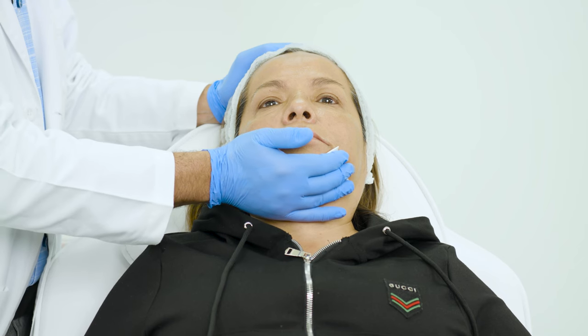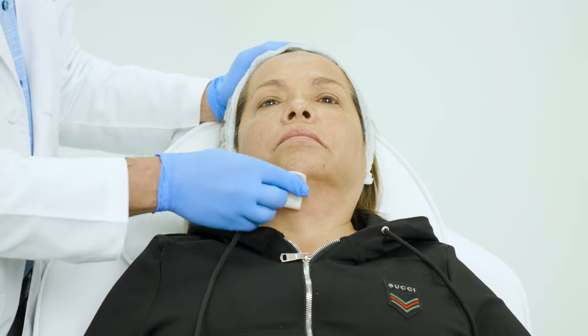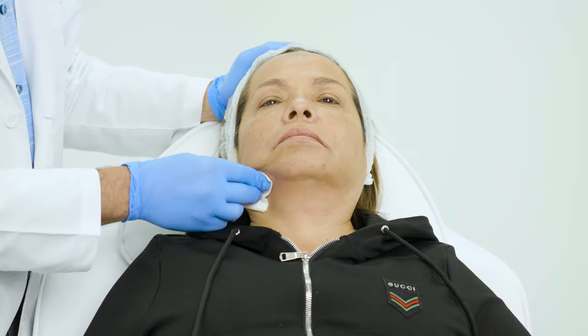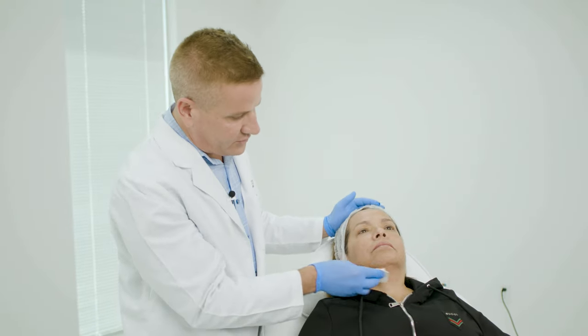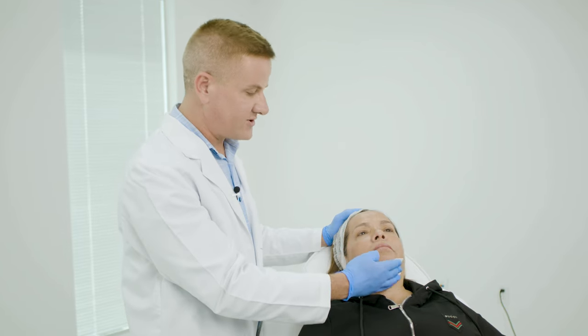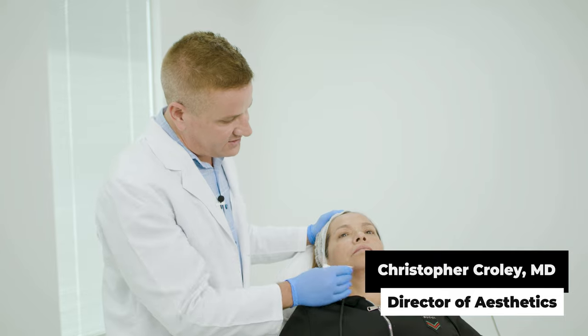And that's it. You can see how simple it is to do a submental treatment with PDO threads — quick and easy, high return on your investment and high patient satisfaction, things we always like. Here at Empire Medical, we focus on not just the technical aspect, but the business aspect of running a medical spa as well. We help you learn your return on investment and how to decide which treatments to incorporate — and this is one that all of you will love once you start doing this.